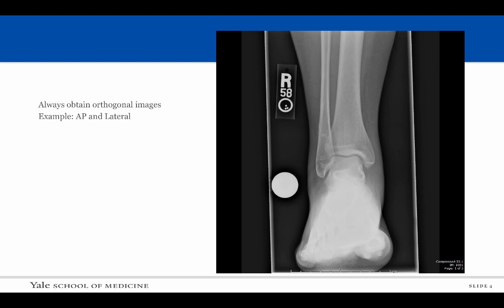It is important when obtaining musculoskeletal radiographs that we image the body part in question in at least two orthogonal planes. Orthogonal planes are perpendicular to one another. An example is the AP and lateral radiograph.